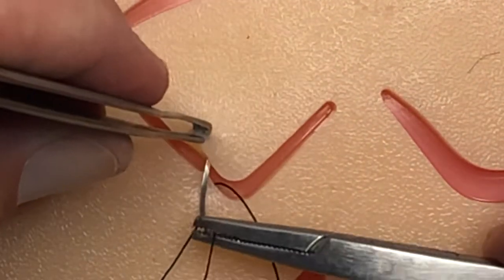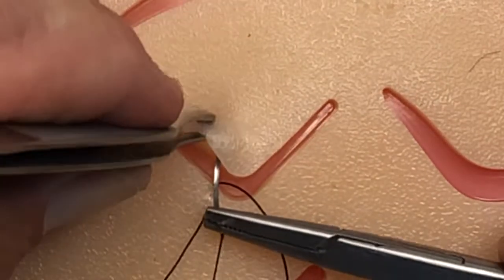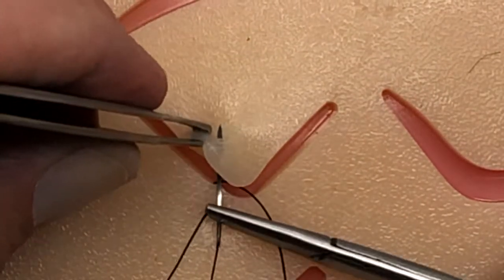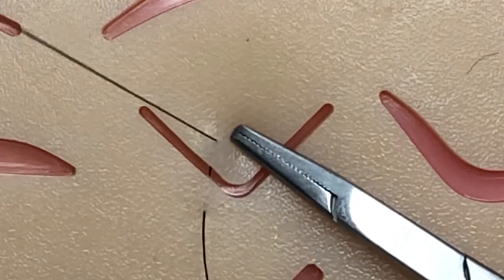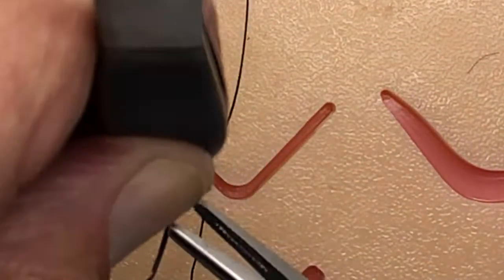Again, using my tissue forceps, about right there. Okay, so I've got enough of the tail.